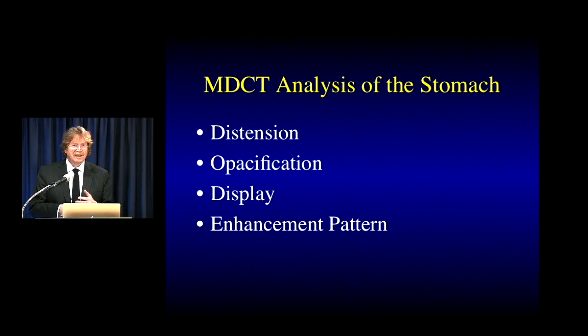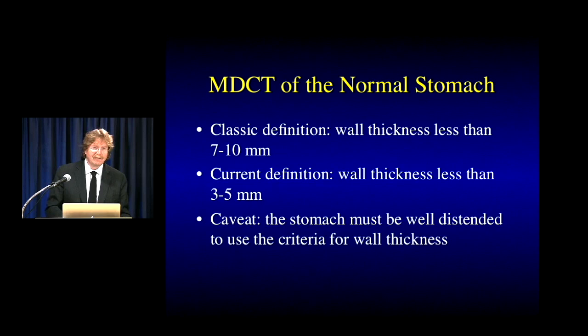If I had to identify the key things when looking at the stomach, I would say distension, opacification, how we display the images, and enhancement pattern. The classic definition of wall thickness in a distended stomach was under a centimeter, but now it's really under five millimeters — with the caveat that the stomach needs to be well distended.